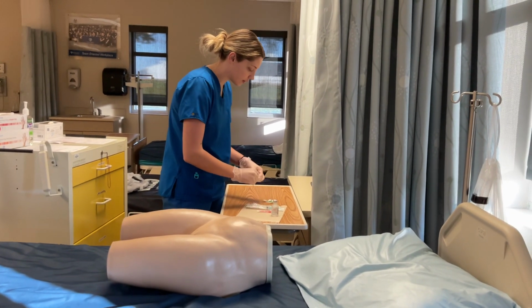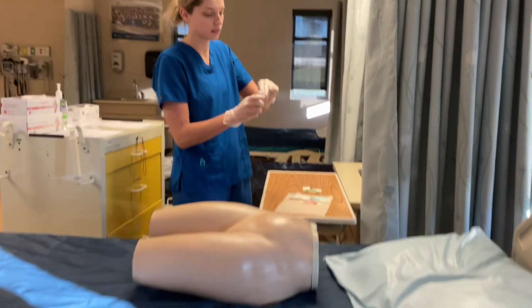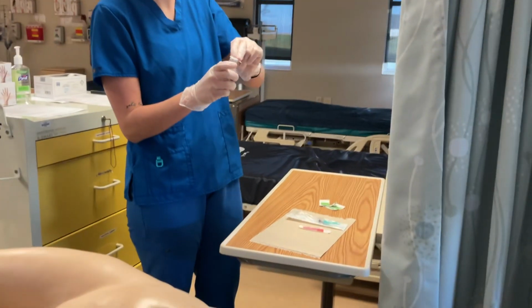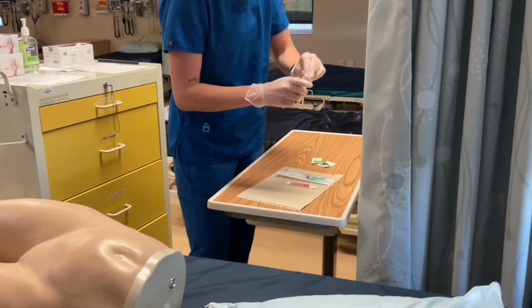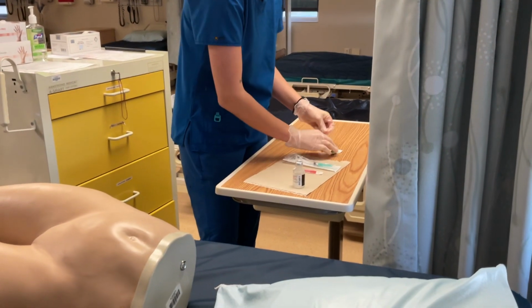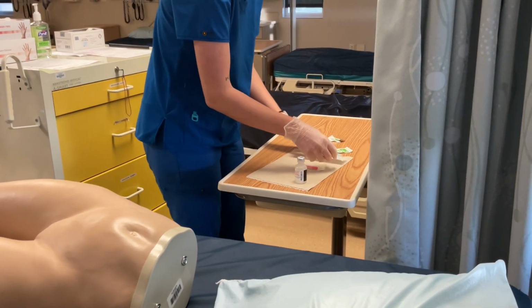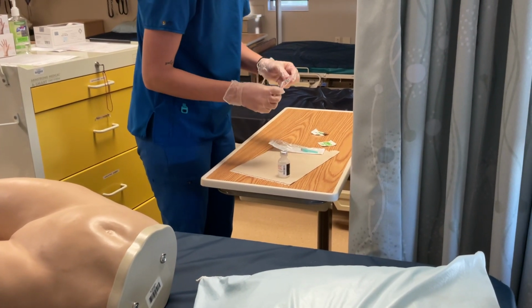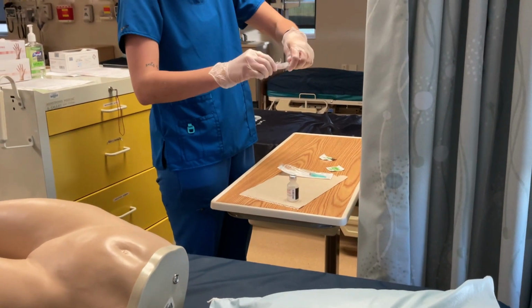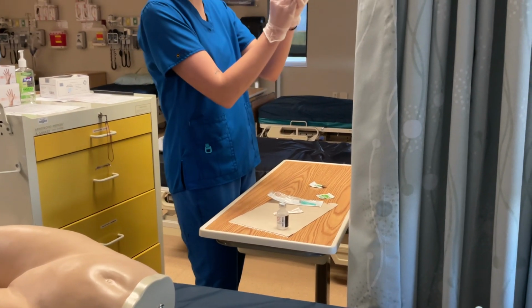So first I would just pop this off and clean for 30 seconds. Okay, 30 seconds. And then I would take this and keep it sterile. And then I'll pull back.